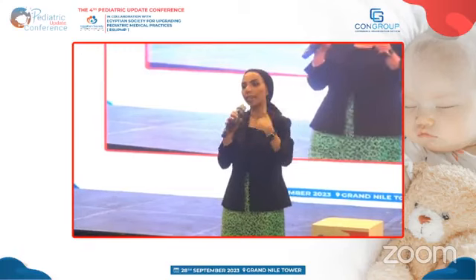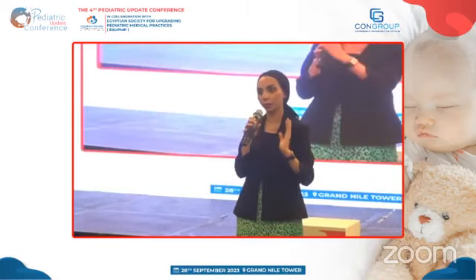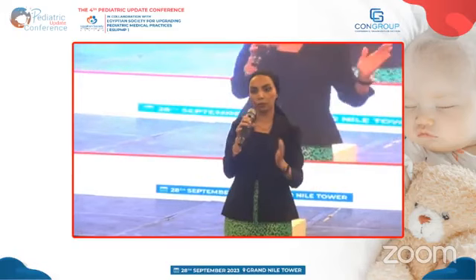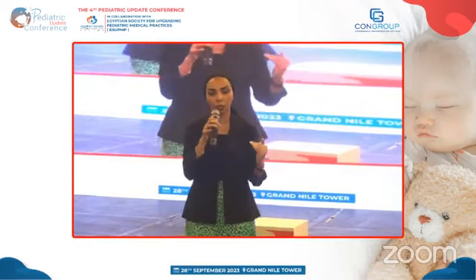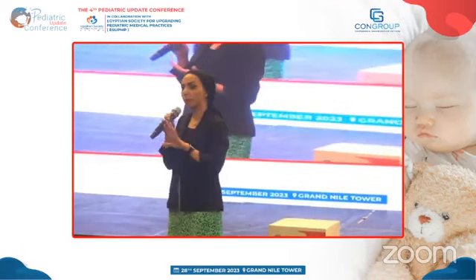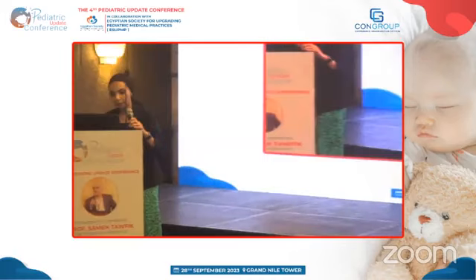البامب طول الوقت هي بتعدل في البيزل اللي موجود. لو لقيت ان البامب وصلت للبيزل بتاعها فور اكزامبل التوتال 25 وانا المانيوال بتاعي كان 20، يبقى لو البيشنت ده شيفت التاني على المانيوال مود عشان هو وقف سنسور فور اني ريزن، هيحصل له ايه؟ هيحصل له هايبرجلايسيميا. والعكس، ممكن الاقي ان السيستم قلل من البيزل، اقل من البيزل المانيوال اللي انا كنت حاطاه. دي اهمية ان انا كل فترة ابدا احاول اعدل في السيتنجز المانيوال بتاعتي، علشان البيشنت لو خرج من الاوتو مود للمانيوال مود يبقى هو في السيف سايد وما يبقاش عندي لا هايبرجلايسيميا ولا هايبوجلايسيميا.